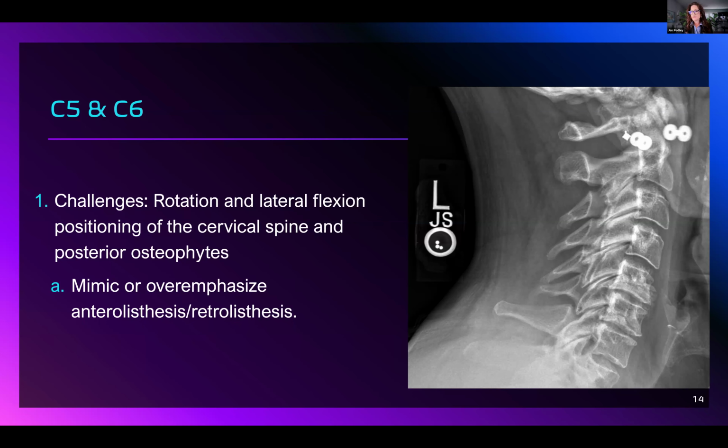I see more degenerative changes at C5, and sometimes with the degenerative changes, it will try to stabilize that area. That's probably chronic, maybe from some other traumatic event, or that's just their normal degenerative change. But yes, more of the C3s and C4s, absolutely. C2, not a lot. But I do see more of the C3, 4, and 5.